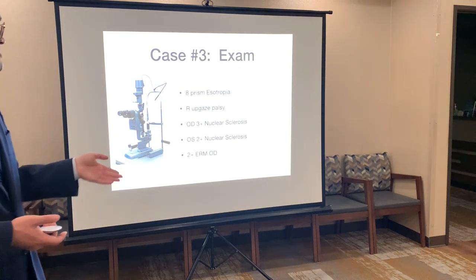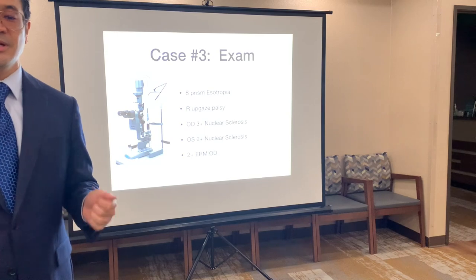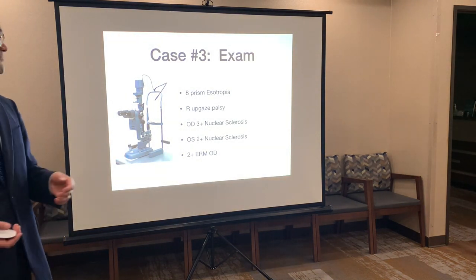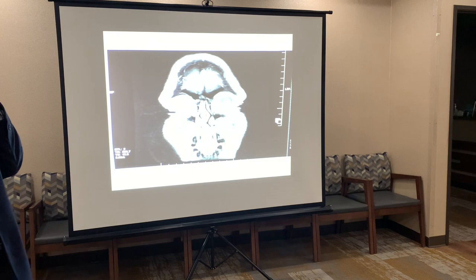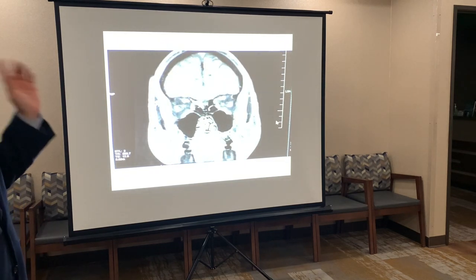So in this case, he came for cataract. He was here for cataract. And he wanted surgery, but there was another problem. So what do we do? Well, we do imaging. So we did imaging, and this is kind of going through the images, and look at that.